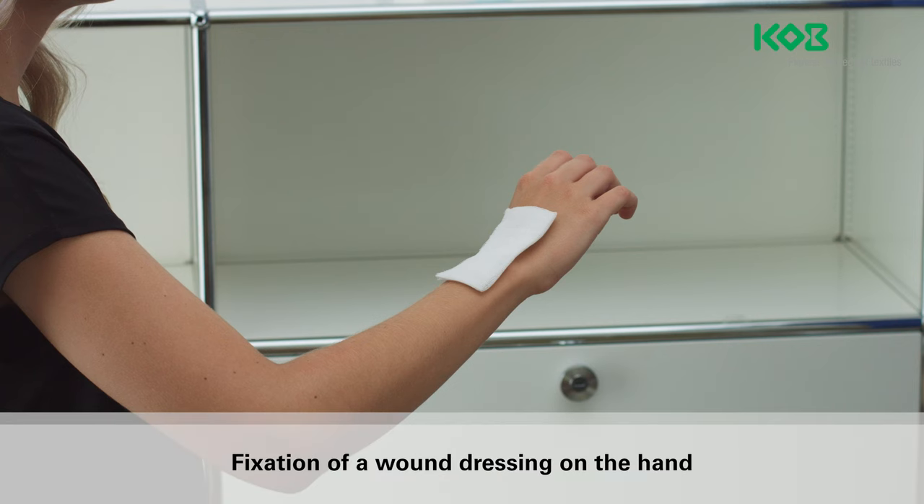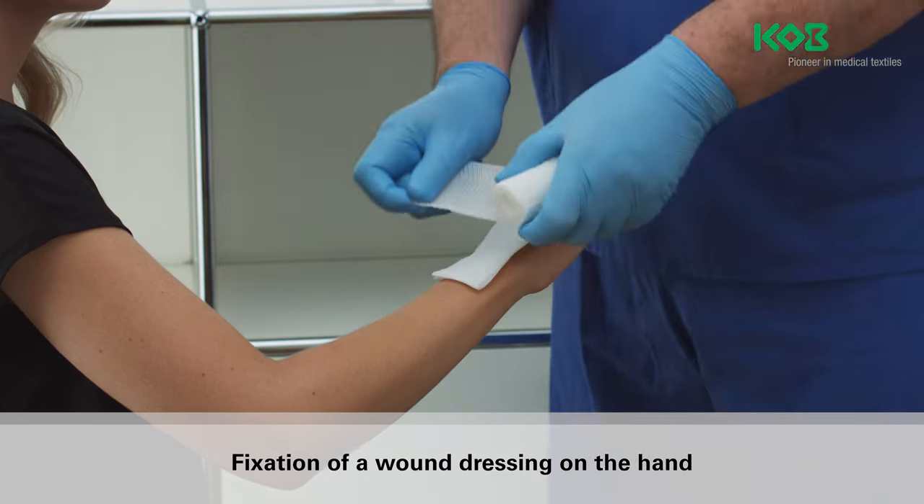Non-cohesive fixation bandages must be applied to intact skin only. Wounds must first be treated with a suitable wound dressing.